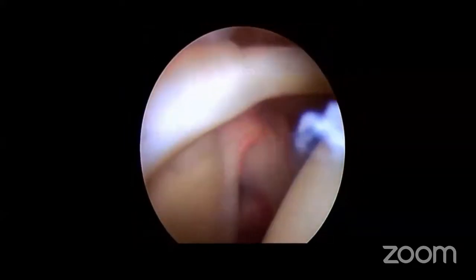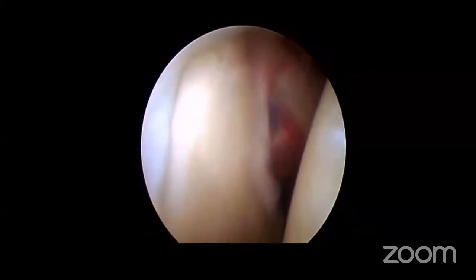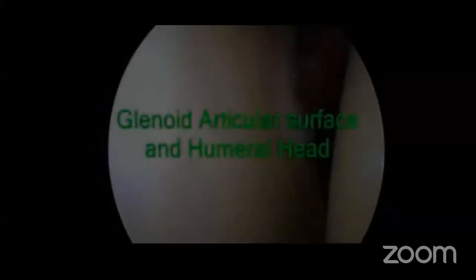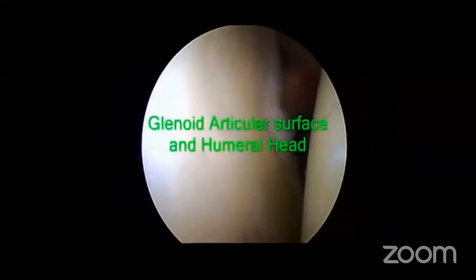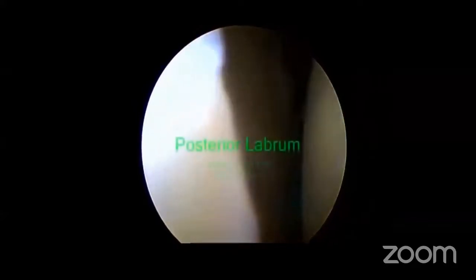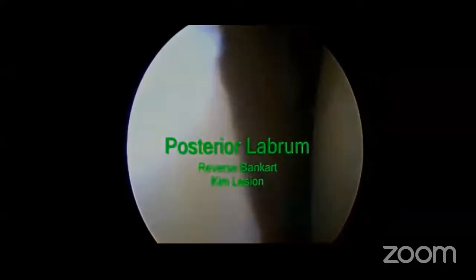So the first thing that you're seeing is the long head of biceps origin, where you are observing for any SLAP tears. Then you move on to the posterior aspect of the joint. The first thing that comes into vision is the articular surface of the glenoid. On the left and on the right, you can see the humeral head. At the center, roughly, of the glenoid, you'll see the bare spot. As you pull your scope out slightly, you start seeing the posterior labrum.